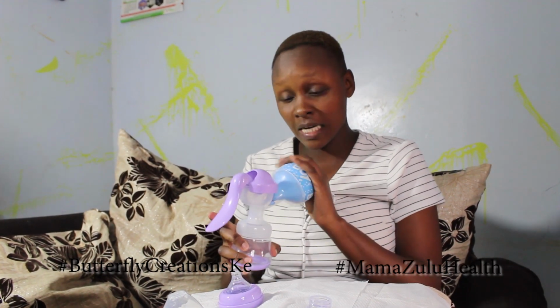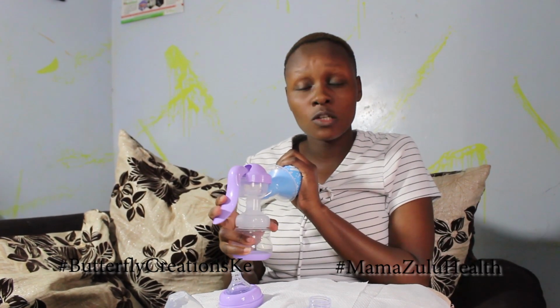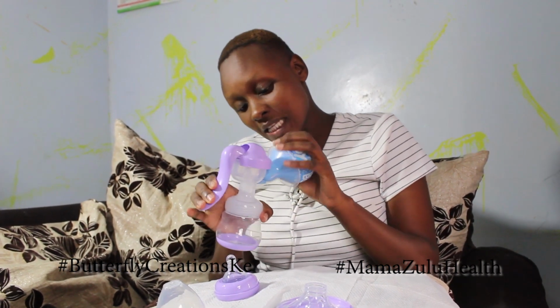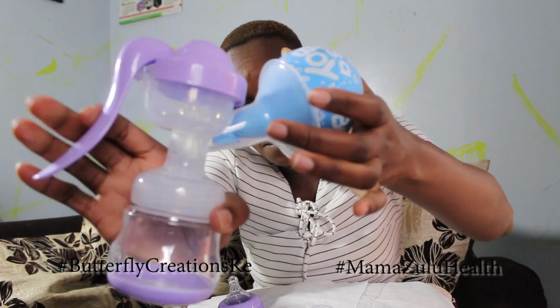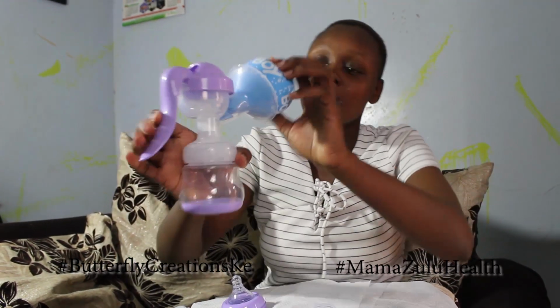If you find it difficult getting the milk out, you can press your breast with one arm as you continue, so that you get the milk much faster than someone who is just pressing the pump. So you continue pressing. You can see this pressure here, and how the pump is sucking the breast. You can see those movements. I hope you can see that. So you continue pressing until the milk is filled.